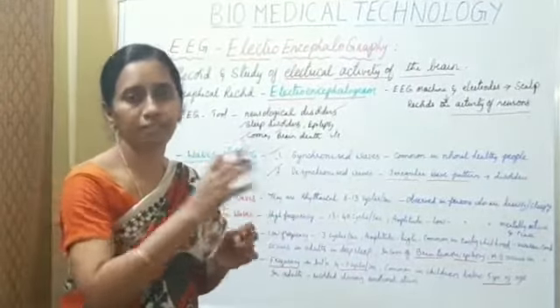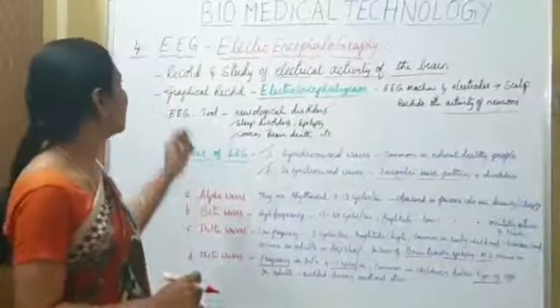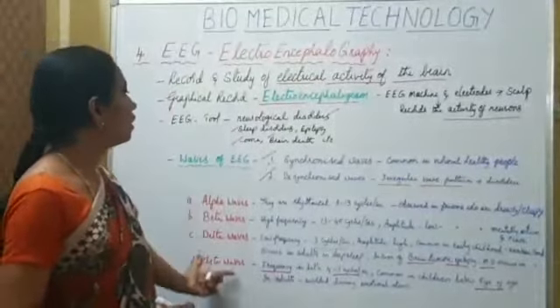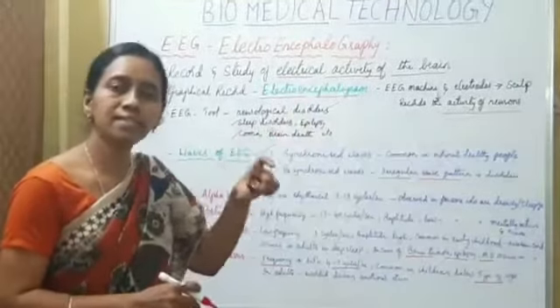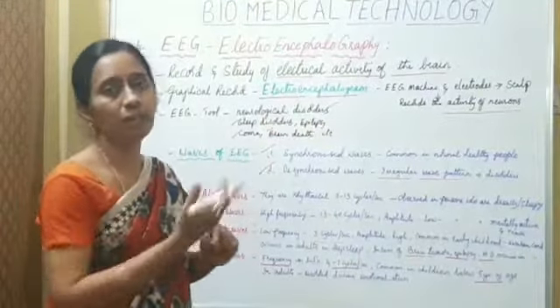Choose a better lifestyle. Okay, so this is the method of observing the waves of EEG so as to diagnose the disorders related to the brain.